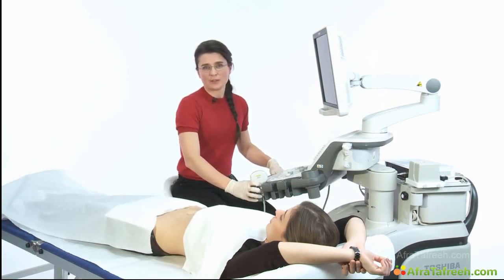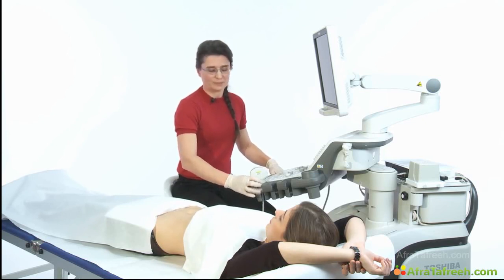This is a lot easier than you might think, and it can help a lot in differential diagnosis of lower abdominal pain. For example, when there's urinary retention or maybe a urinary catheter not doing its job well. But before we start, I want to tell you a few words about the transducer we use for this examination.